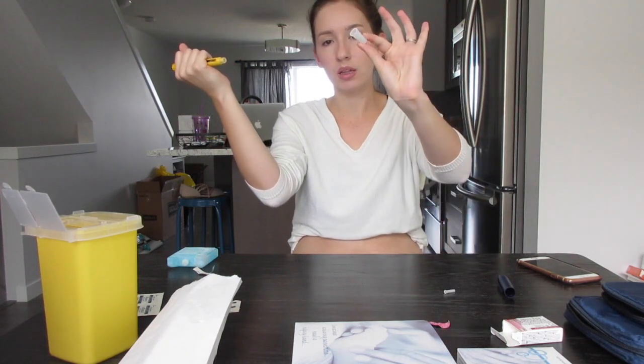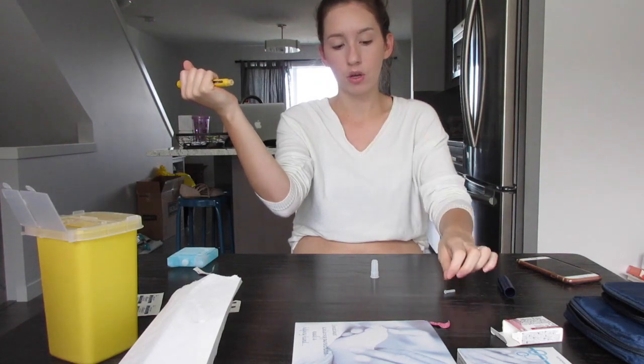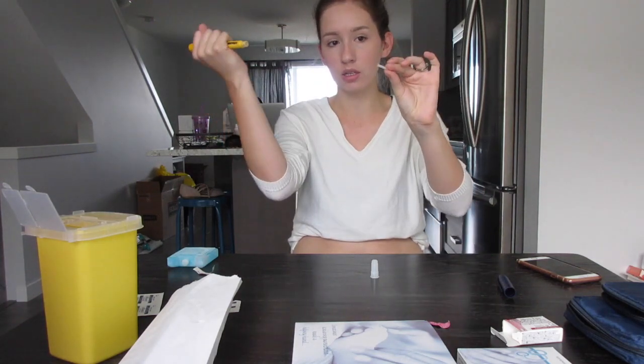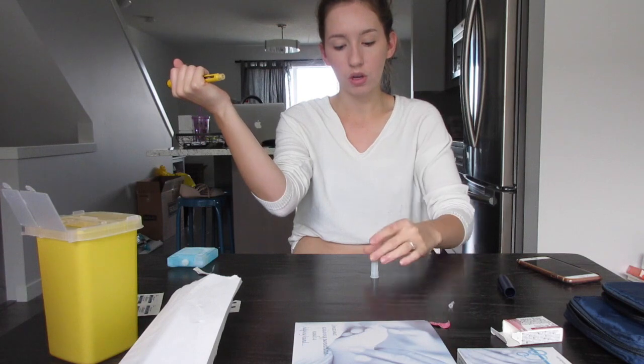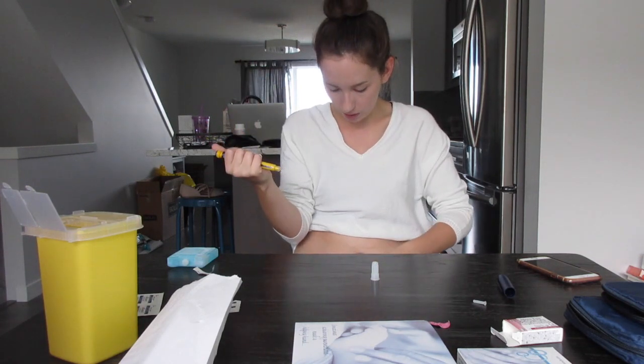Keep this big lid that you had before close because you will use that to take the cartridge off. Do not use the small lid because it's easier to poke yourself. Use the big lid, that way it's better for that.